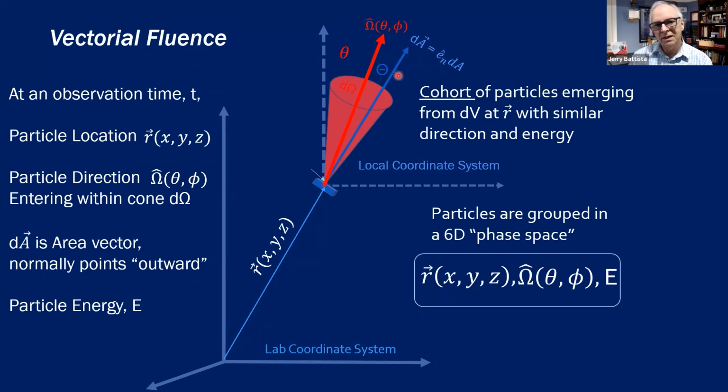And we can also monitor, by using a perpendicular to the surface element, whether the particle is leaving a structure or coming into the structure, because you can do a dot product, and the cos of this angle will determine if the particle is going out or coming in. So that's very useful.